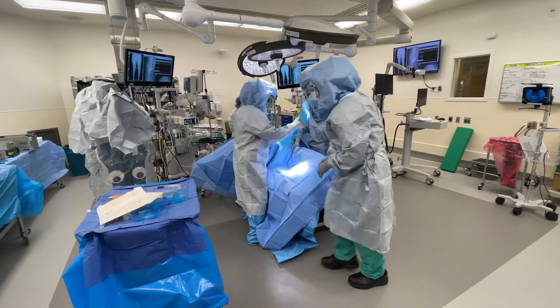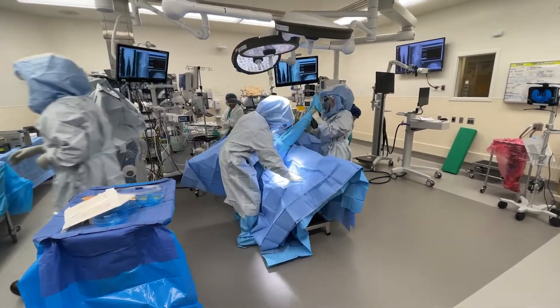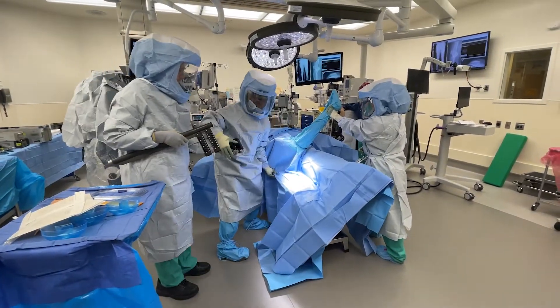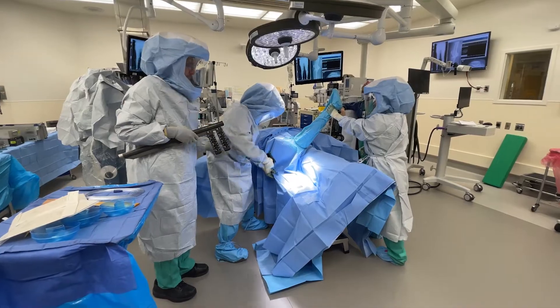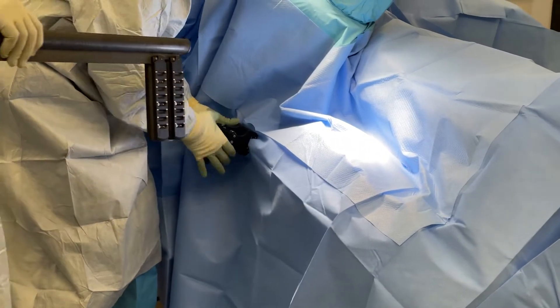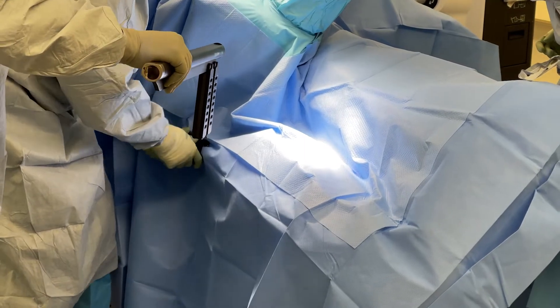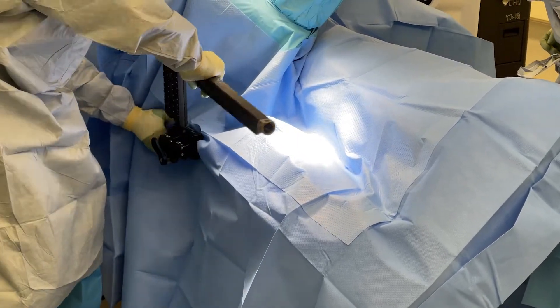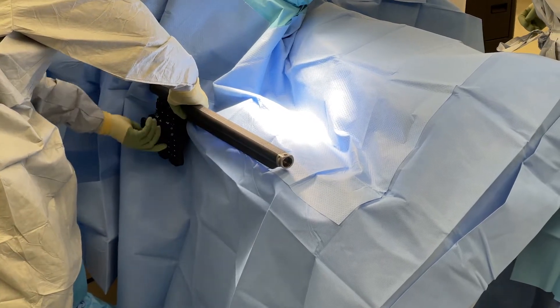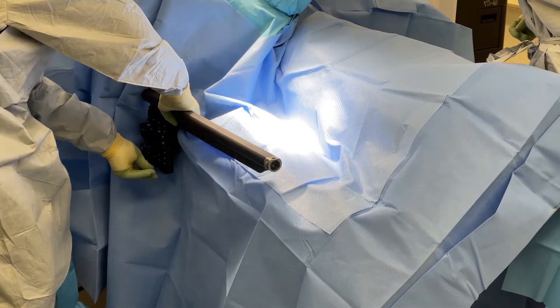I then hold the leg in an extended tuck position and leave some slack in the drape. Then I attach the leg holder to the rail. An important note here is that the bed sheet should not cover the rail.